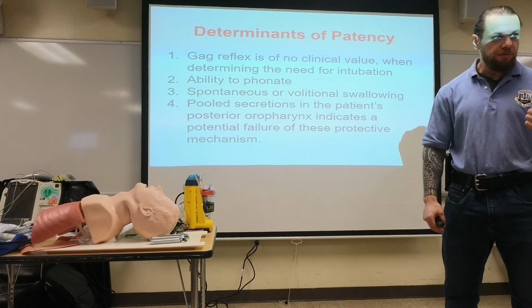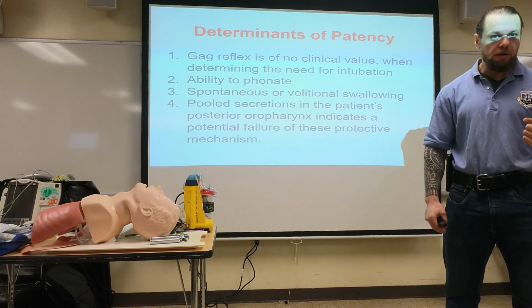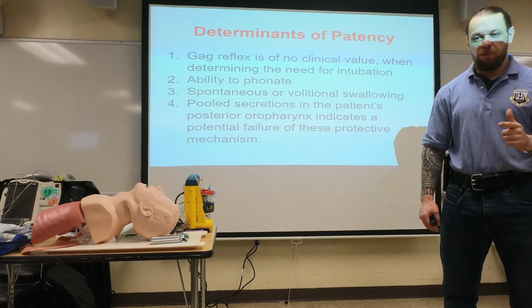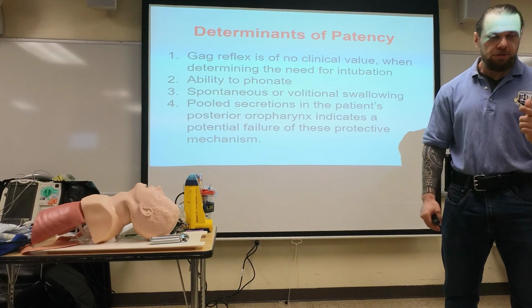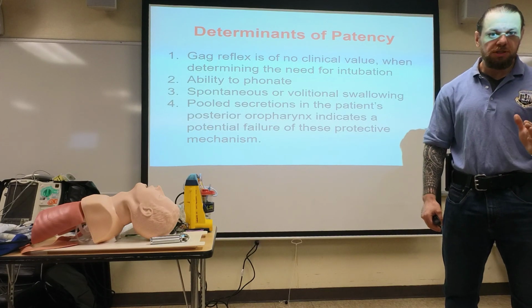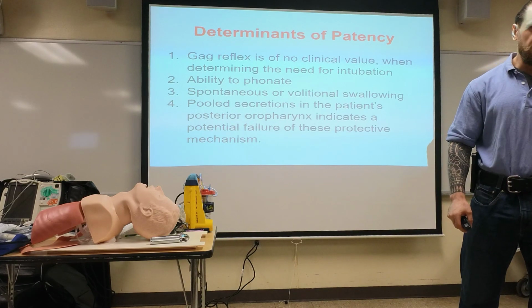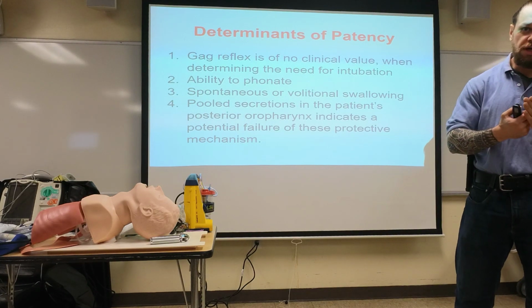So one thing is what? Phonate, make sound, right? And the other one is to swallow. If the patient cannot protect their airway, they need to be intubated. If they cannot maintain the airway, they need to be intubated. We usually say if they cannot maintain the airway, they cannot protect it either. So protection and maintenance have to be together.